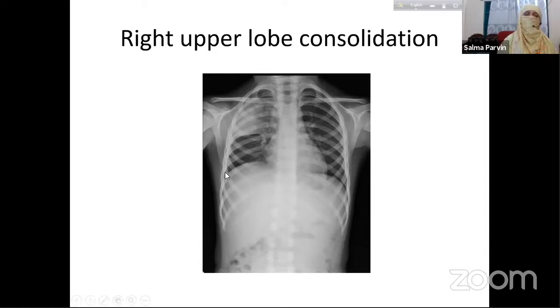It is a very important comment in the context of radiology, because when the normal appearance is absent and you cannot see properly, that is really pathology. So a large consolidation is present here, and the terminology you can use here is blunting of the right CP angle. The conclusion is large consolidation with small right pleural effusion.